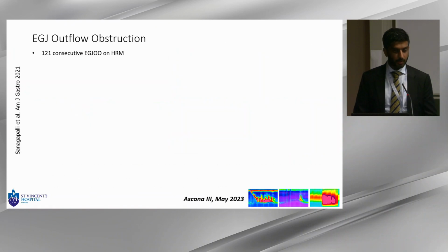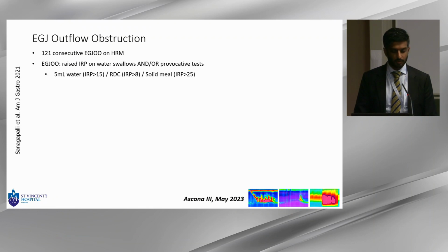So a couple of years ago, we reported on 121 consecutive cases of EGJ outflow obstruction. And in this study, we included everyone with some intact peristalsis and raised IRP on any test, whether it was 5 mL of water or the provocative tests, according to the specified cutoff criteria.